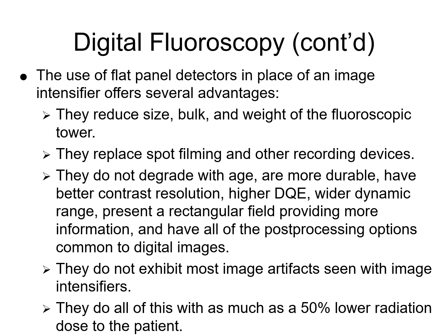So we have software that is capable of producing dynamic range images with 30,000 shades of gray, no problem. But the problem is if you put that on the monitor, we'll only be able to see about 15 different shades, even though there's actually 30,000 shades there. Okay, but we'll speak about that in digital imaging. That's where AI comes in. A computer software can see more shades of gray than we can, and can detect aberrations, if you will, in the picture that a human eye couldn't even see.